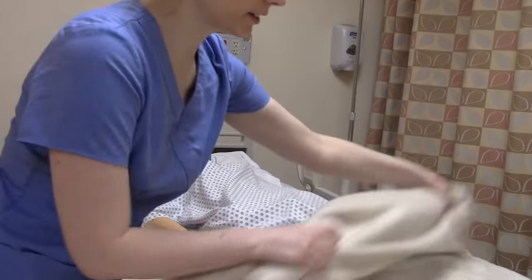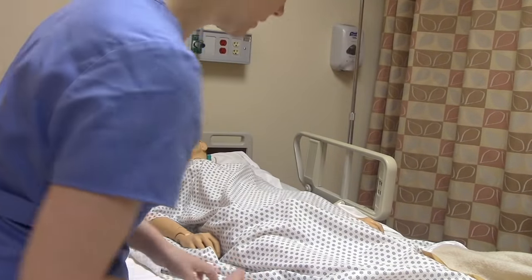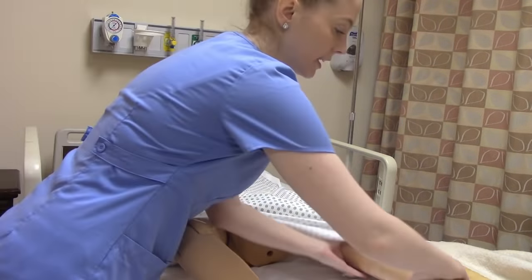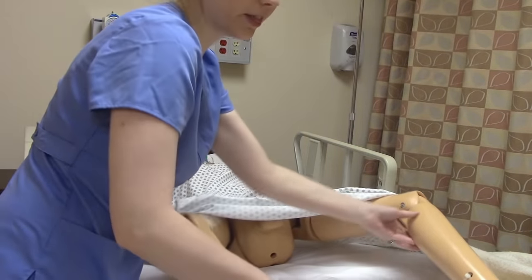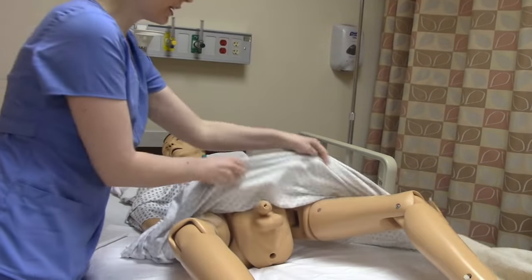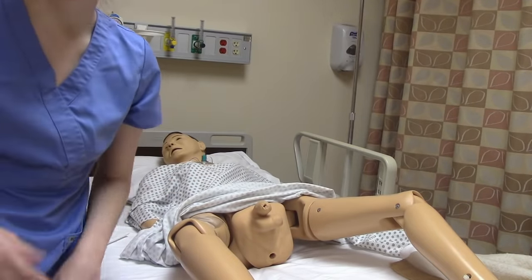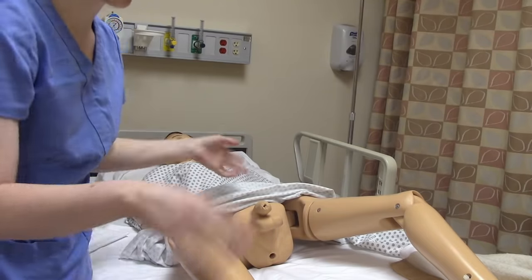Pull down their covers. If they're capable, have them bend their knees — not every patient will be able to do this, such as after a hip or knee replacement, but it's much easier if they can bend their knees and spread their legs a little. Then expose the area. Get everything ready beforehand, because once you start opening your kit you need to be sterile and don't want to accidentally touch something like a gown or blanket.